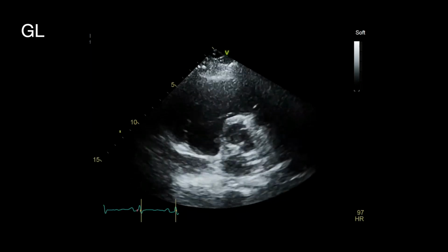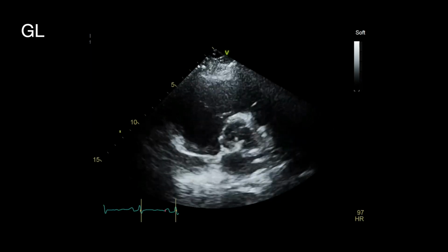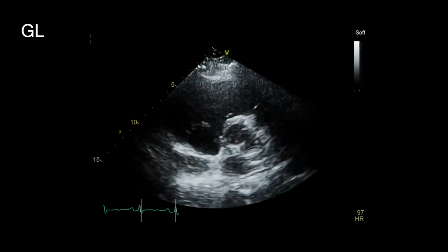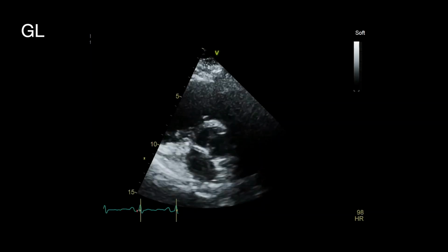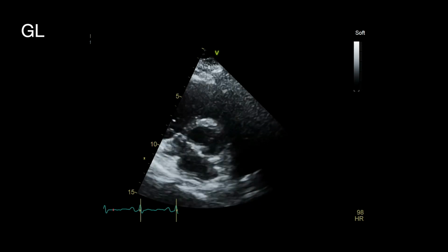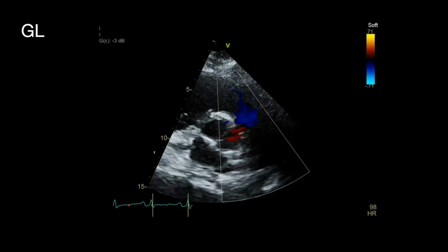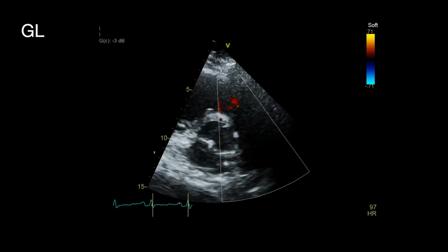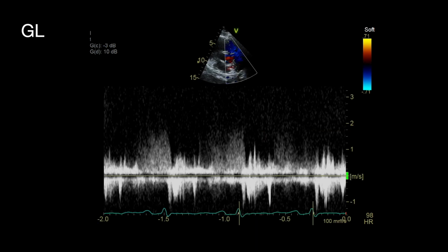Now we're in the parasternal short axis view at the level of the aortic valve. You can see the tricuspid valve to the left of screen there, and the pulmonary valve flickering in and out on the right. And they've swung the probe around a little bit just to try and focus on that pulmonary valve and RV outflow, to optimize the acquisition of the PR jet and repeat those measurements with continuous wave, to see if they can optimize the image any more.